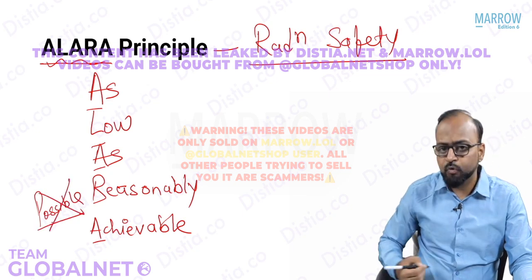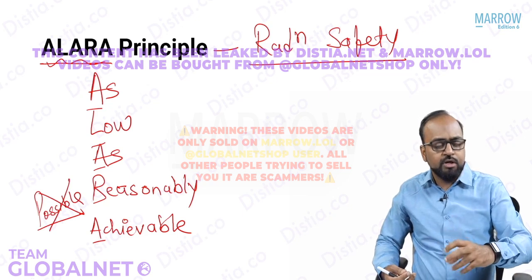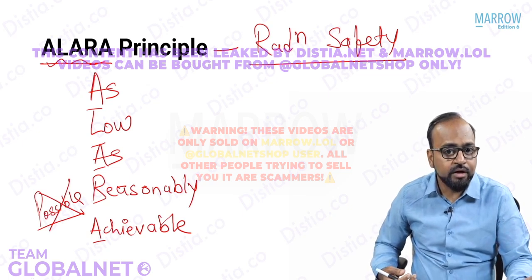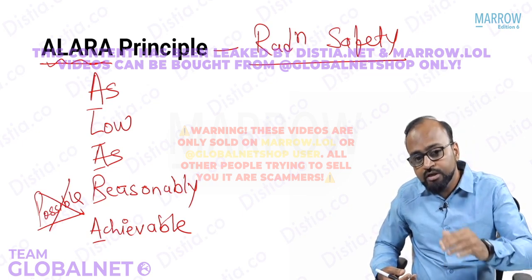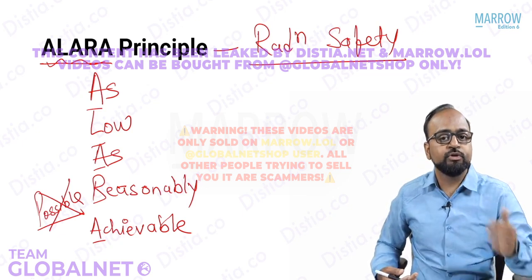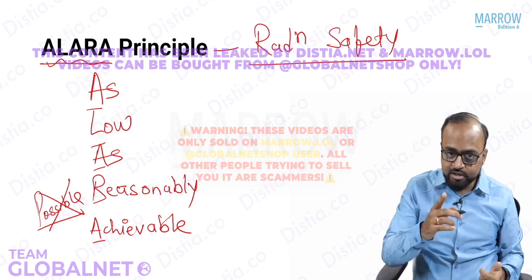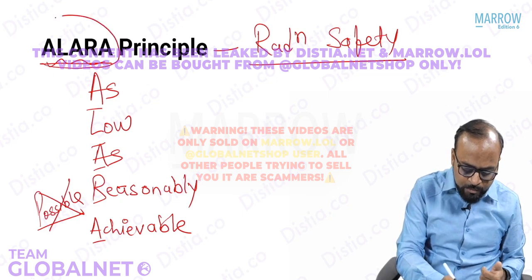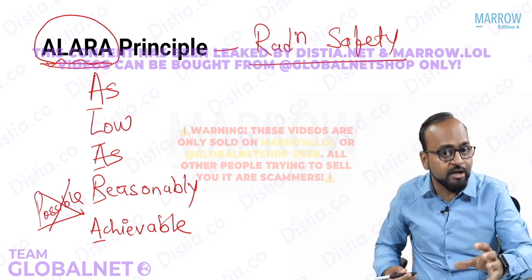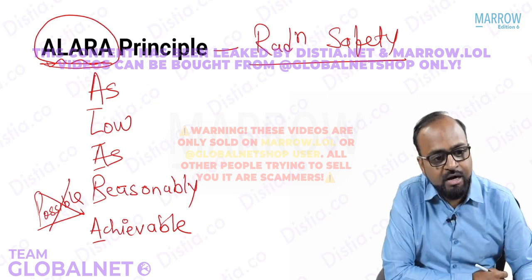The answer is no. Why? Because if I make sure that the radiation exposure to the patient's body is as low as possible, then though the radiation exposure is very low, the image quality will be compromised. I will miss my diagnosis on the image. So what is the purpose of doing the X-ray then? Therefore, the principle of radiation safety says that the radiation exposure to the patient must be as low as reasonably achievable, so that the radiographic image quality is maintained and, at the same time, the radiation exposure is low. So this is the principle of ALARA.